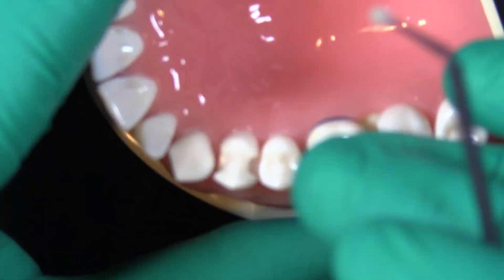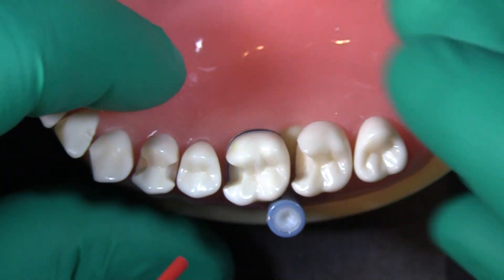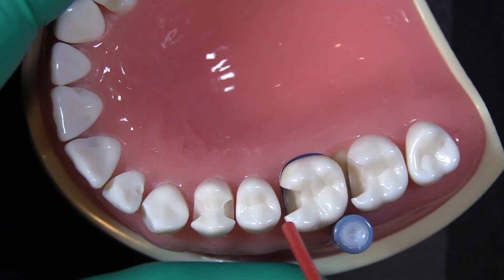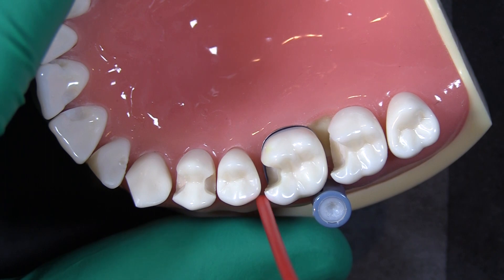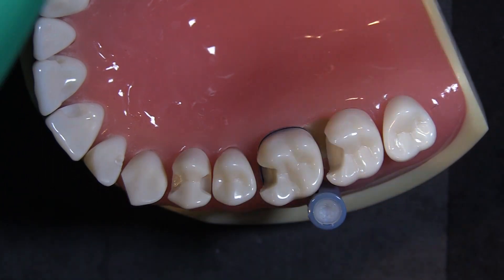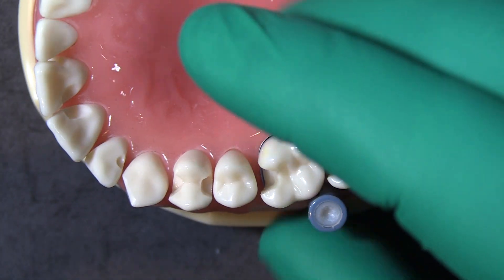Then hit that with some air to thin it out. You can see it as you blow air — the bonding agent moving around — and then you'll see it kind of stop moving around, and that's when we know we're in a good spot. If at any time you notice you're contaminated, that's a red flag.